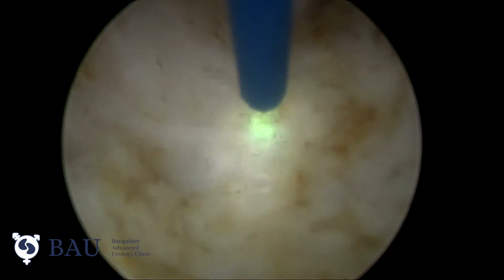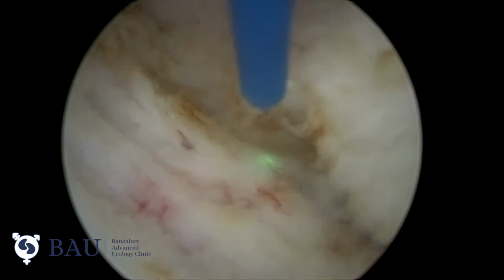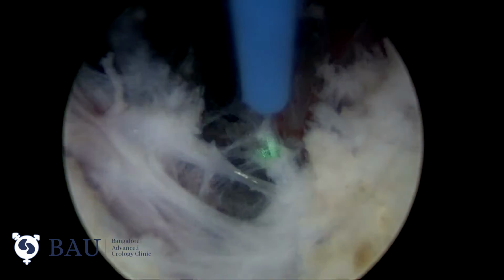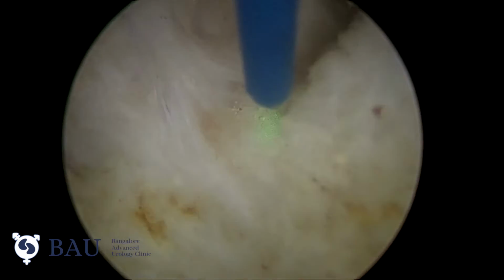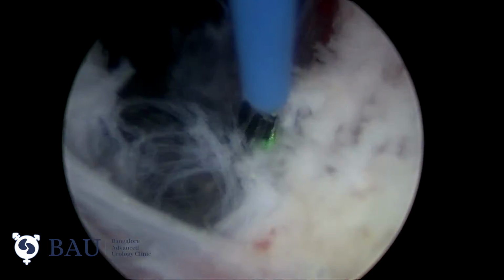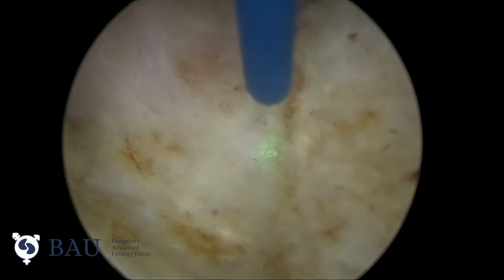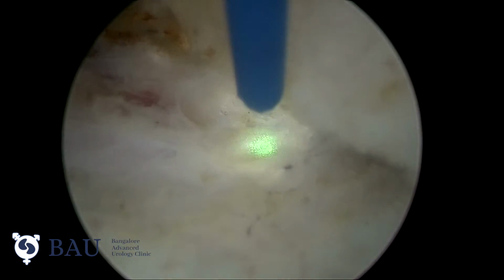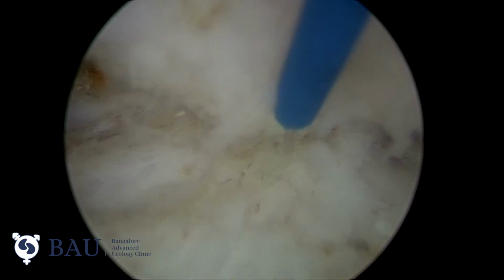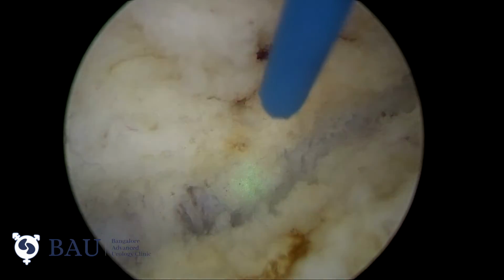And since we have already dissected posteriorly, joining these two lines gives a safe plane and avoids any undermining. So the bladder neck will be preserved, and it's easy for us to lift the gland and push it inside the bladder. Now our job is to join the lateral dissection area into the posterior dissection area, and in the same way we are going to dissect on the left side of the patient.